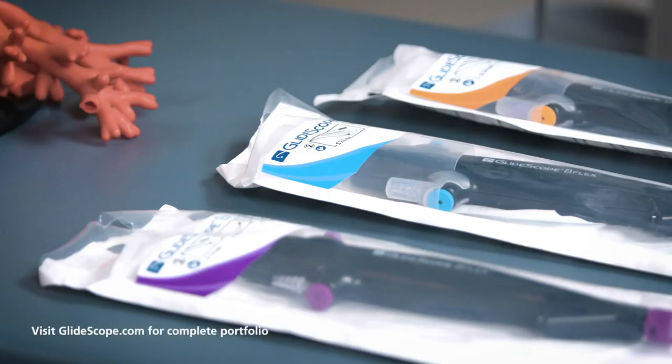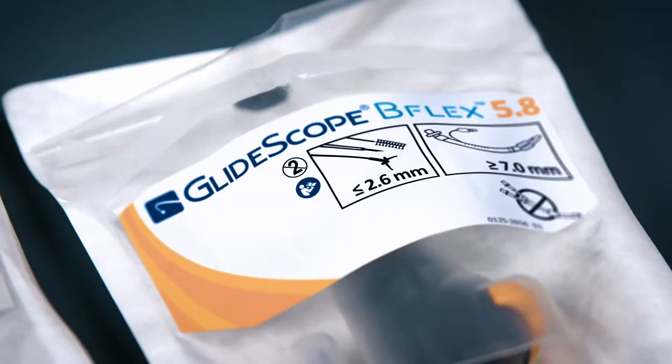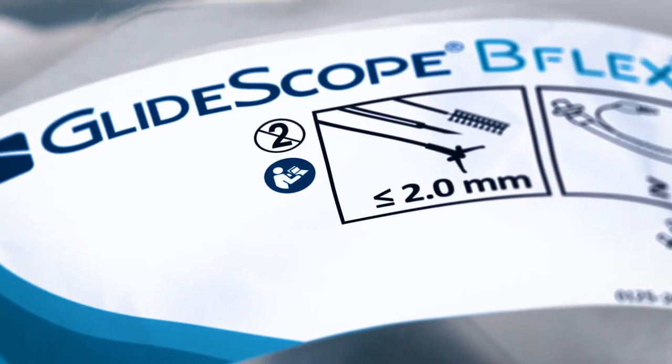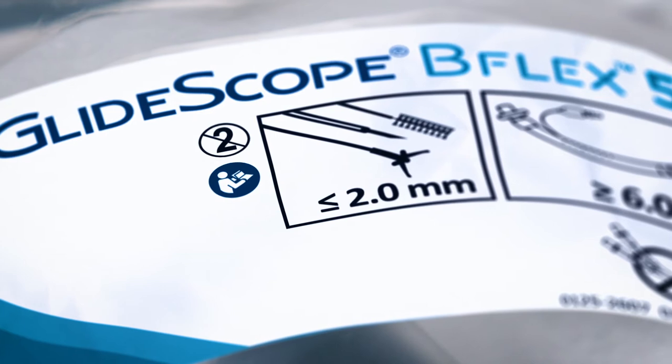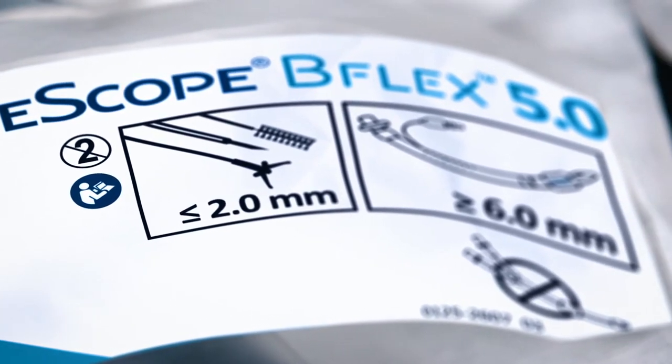When choosing our bronchoscope, you can see that we have three different bronchoscopes to choose from: a B-Flex 3.8, 5.0, and 5.8. The packaging is color-coded according to the size of the insertion tube, and it tells us at the top of the packaging the minimal diameter of endotracheal tube that can be accommodated by the bronchoscope. Here I'll be using a B-Flex 5.0, which can accommodate an endotracheal tube of 6 millimeters in diameter or larger.